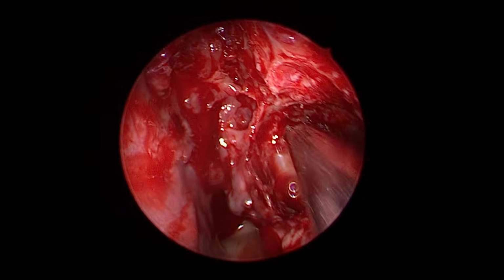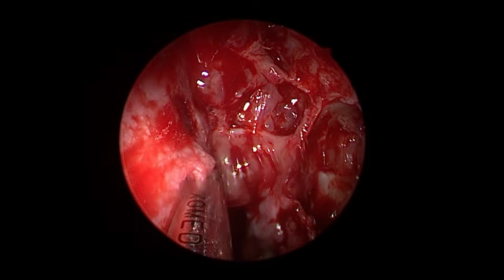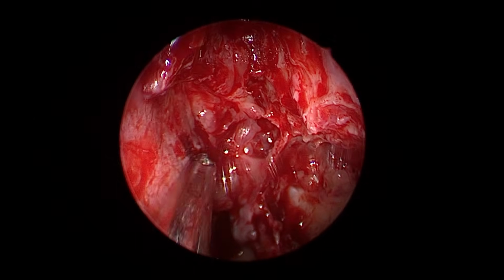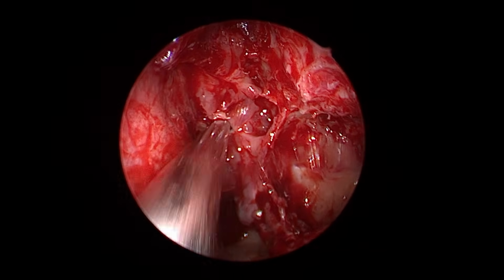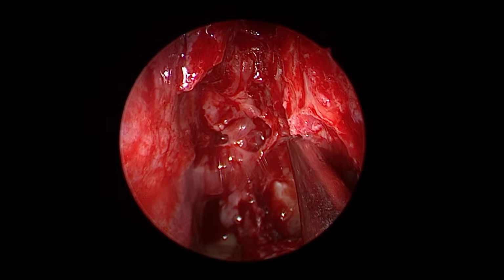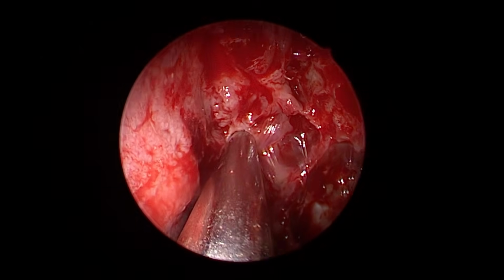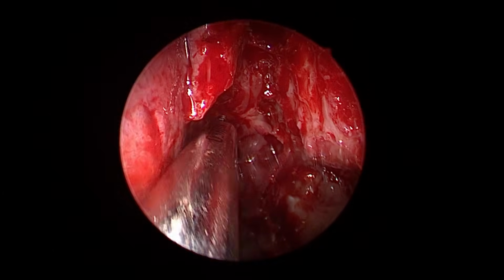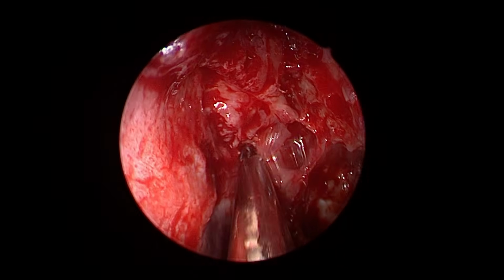See now, how to open the sphenoid? Simplest way. See my maxillary sinus roof level? Go along the septum. See, this is the nasal septum. Absolutely flush with the septum, just below the level of the roof of the maxilla. See this? Yes, I am in the sphenoid. If I don't take this into consideration and try to go higher up, I will breach the skull base and get a CSF leak.